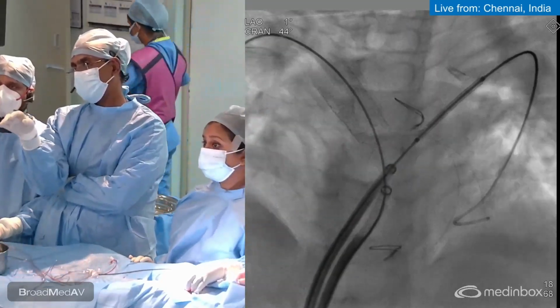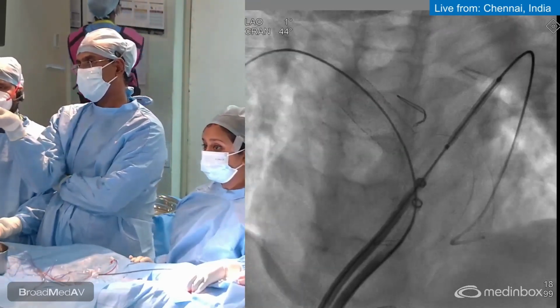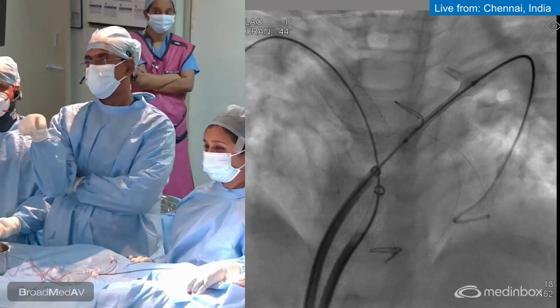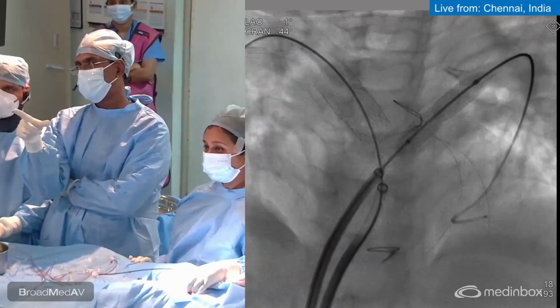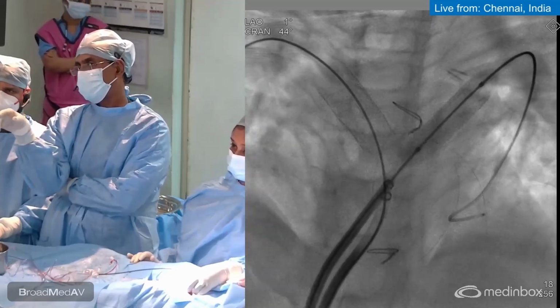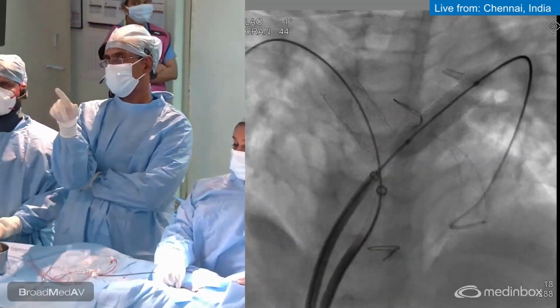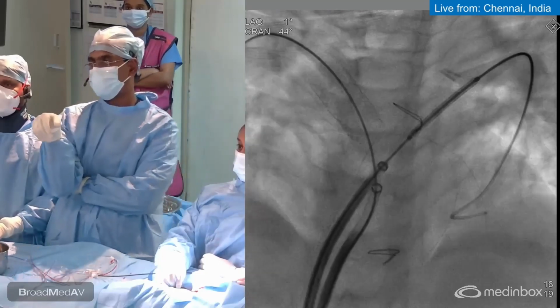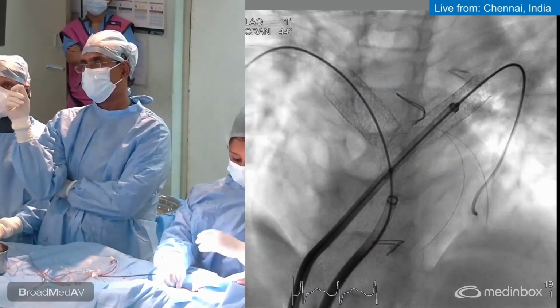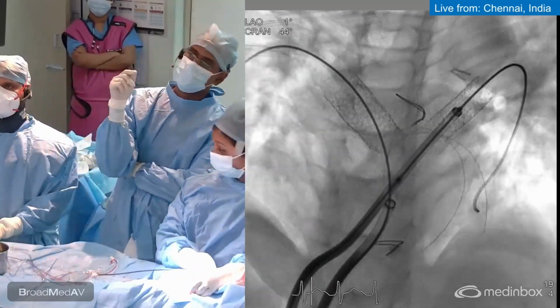Yeah. Here, when we are expanding, the proximal end of the left pulmonary artery stent is on a horizontal level with the proximal end of the right pulmonary artery. Let's see it. Here, it's at horizontal level. If you look at it in relation to the sternal wire, it's below the sternal wire. Show the next picture. A little bit of migration.